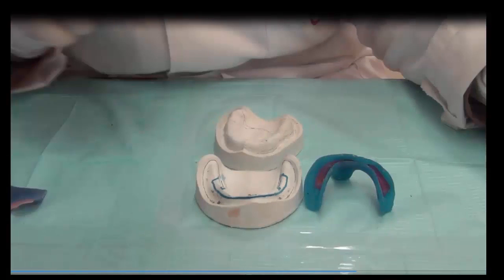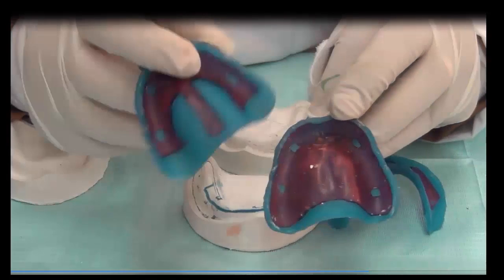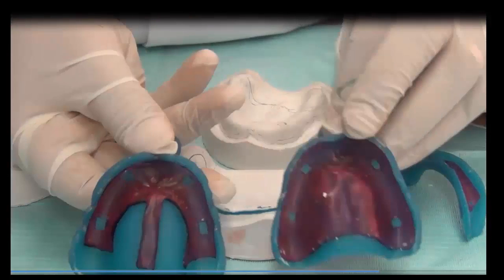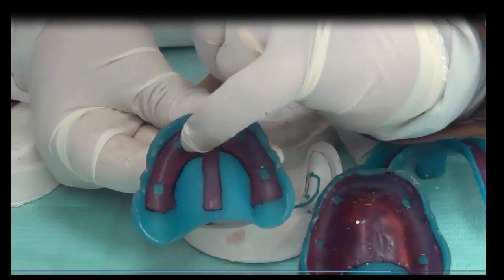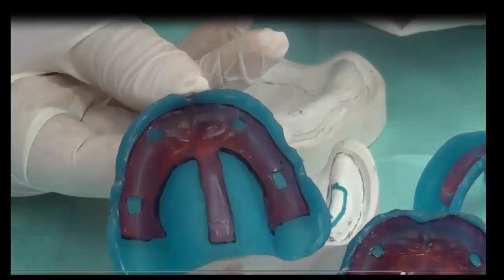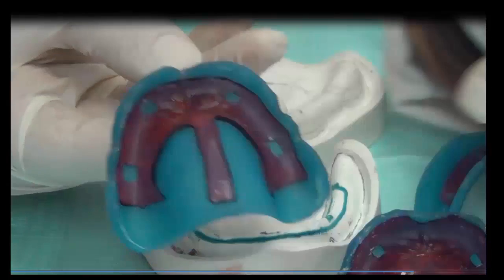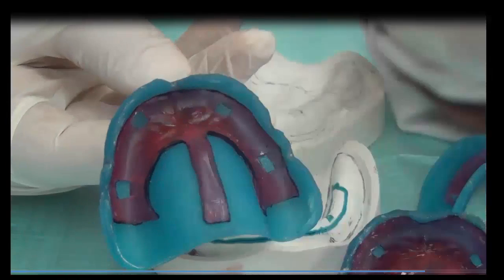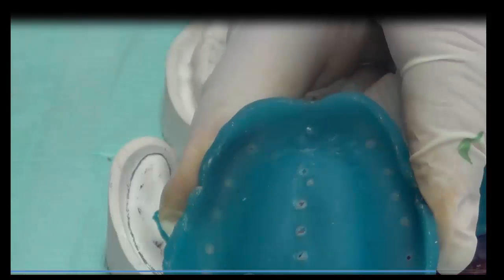For those trays that have a relief, this is also another way for the upper. This is called full relief because it covers all of the anatomy, and this is called partial relief. It covers part of the anatomy. And from the inside, I could see that for the relief, we have what we call stoppers. These are spaces in the wax that acrylic material has filled in, so they will act as stoppers, preventing overseating of the tray. So parts from the inside are the body of the tray, closely fit, and sometimes relief areas and stoppers if we have relief, or perforations if we have the perforated type of tray. So these are the part of the trays.